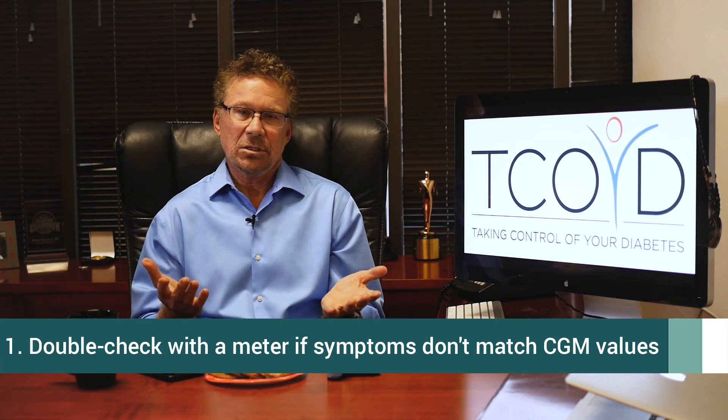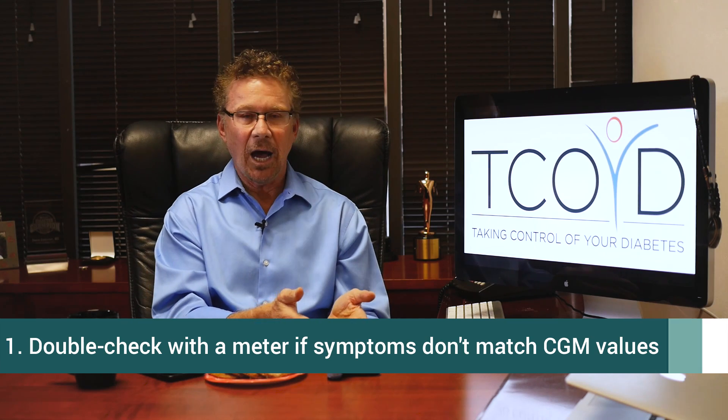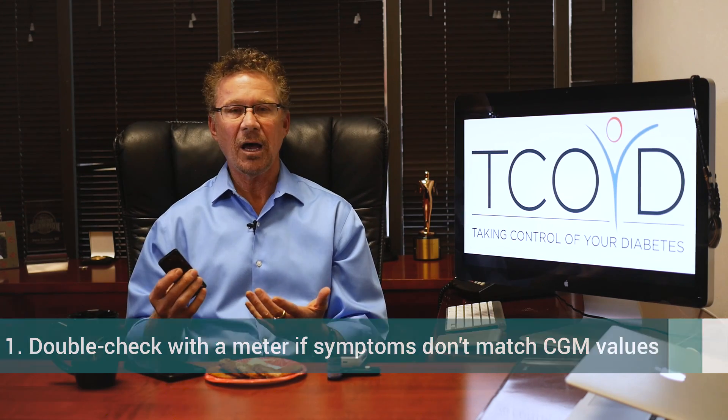Now there are a couple of situations that are really important to know when you want to check your blood sugar with a meter and not rely on the CGM. The first one: if your symptoms do not match your value on your CGM, just test your blood sugar. You might get an extremely high number on your CGM and not feel high, and vice versa — you might get a really low number on your CGM and say, 'I don't feel low.' You'd better double check, especially if you're giving yourself insulin.